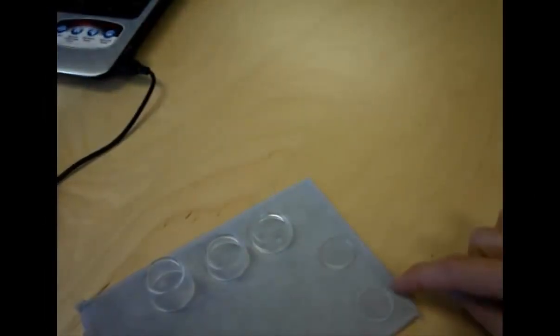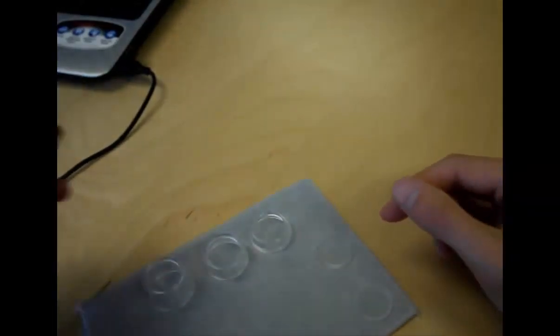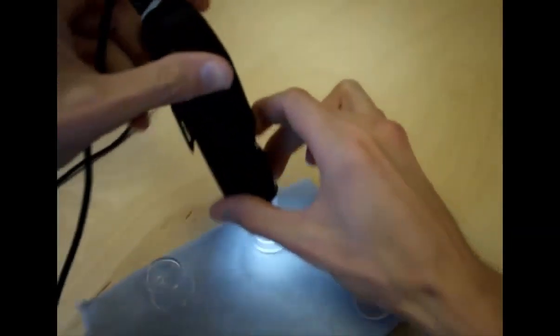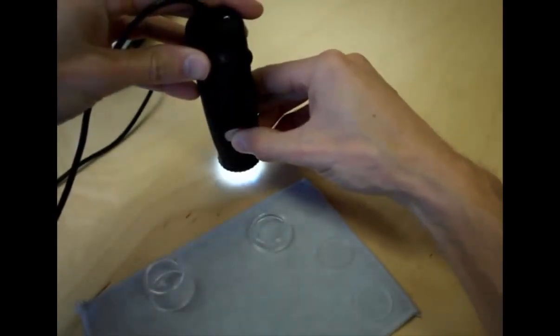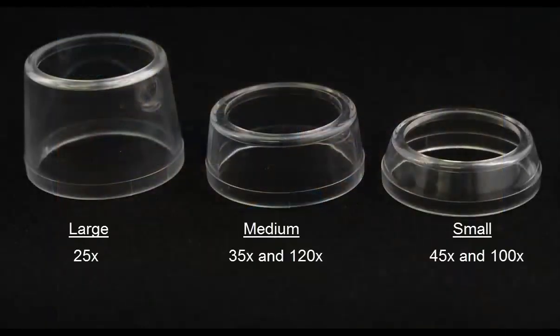The Tricoscope also comes with 2 glass covers and 3 scope spacers, which serve for various functions. The scope spacers also create a space between the camera and the target, which enables each one to achieve different levels of magnification, which can be used for different procedures. Here's a table that shows the different levels of magnification that each size can achieve. Feel free to pause the video at any time you feel necessary.